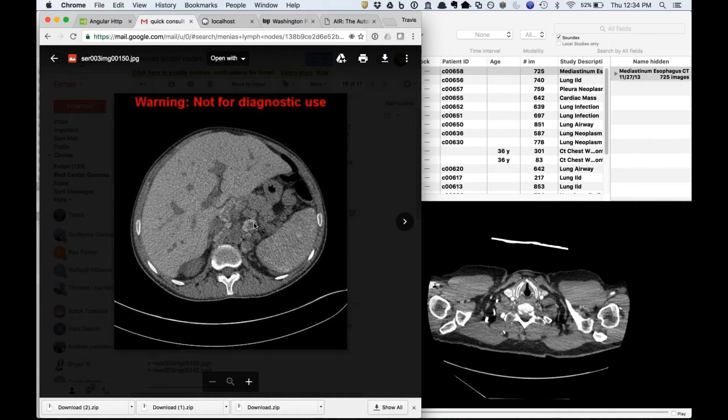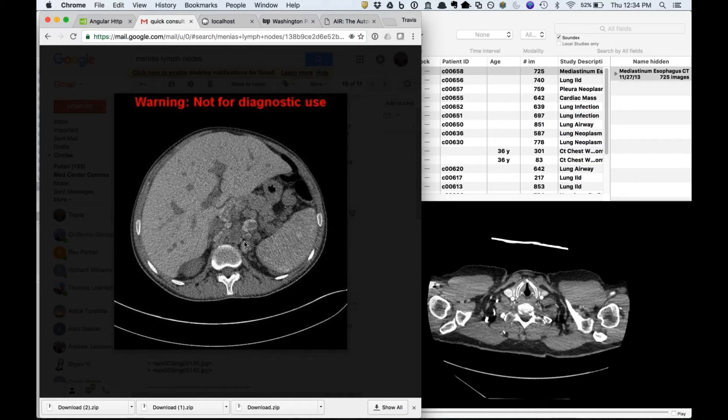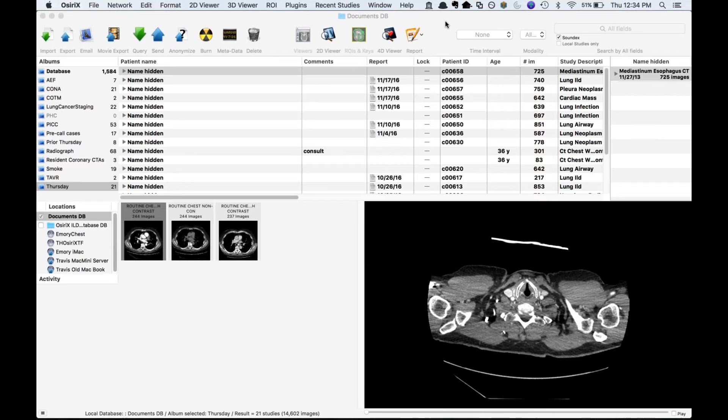The next presenter shows a companion case to the iron overload lymph node case — a patient with sickle cell disease from early Emory days with high attenuation lymph nodes in a similar porta hepatis location. A body imaging attendant confirmed she had seen numerous cases of iron deposition in lymph nodes in patients receiving chronic transfusions. The current presenter's case was myelofibrosis or a variant thereof.